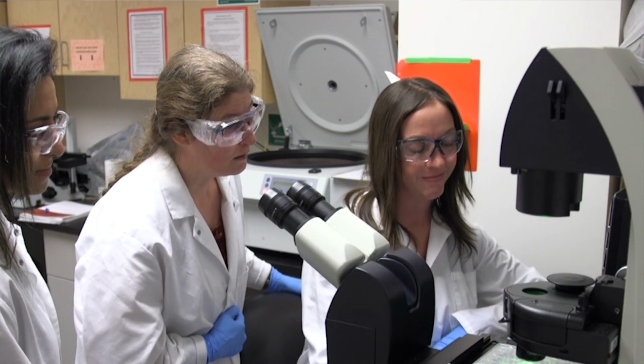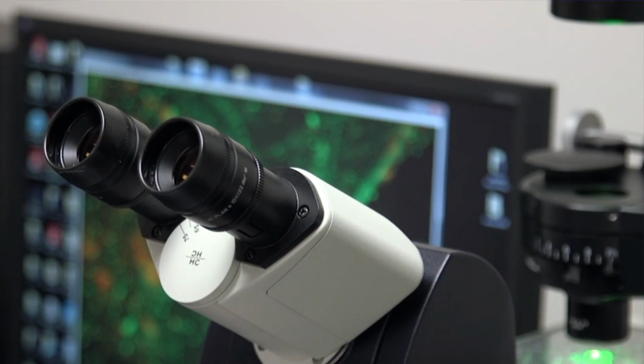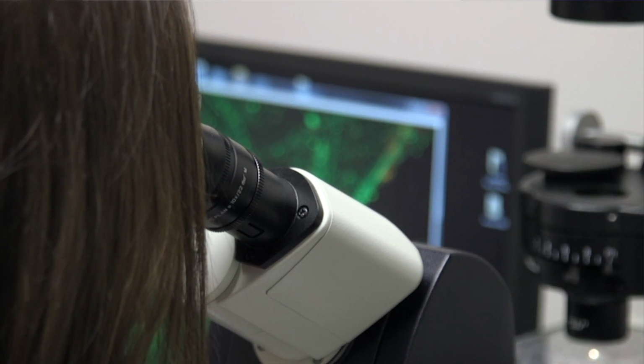Another really cool thing about kinetic-based systems is that because you're just looking at an increase in signal over time, there's a slope element to it. And depending on the amount of analyte in there, it increases the slope, and therefore you can detect the level of analyte that is in that sample, which is super handy.